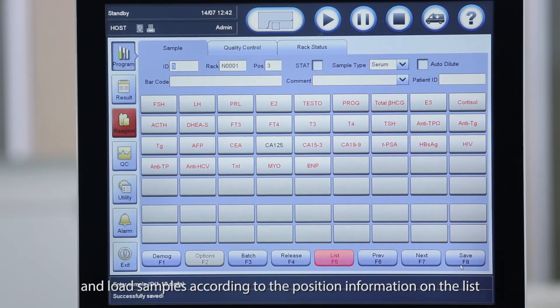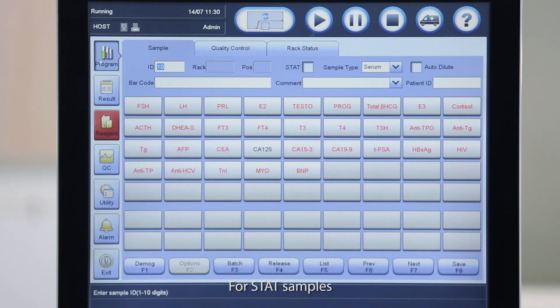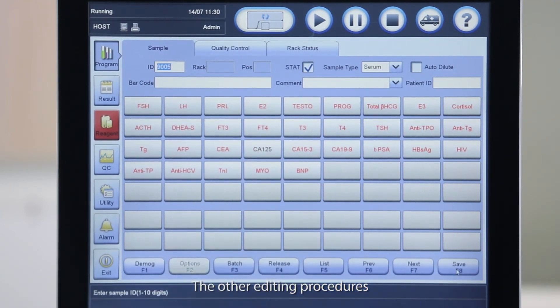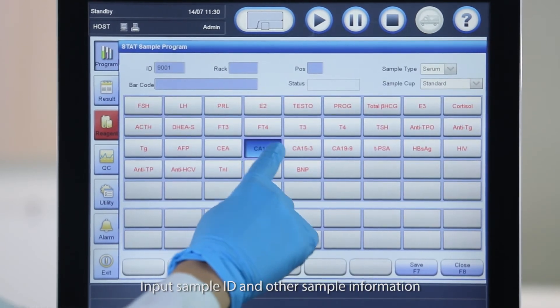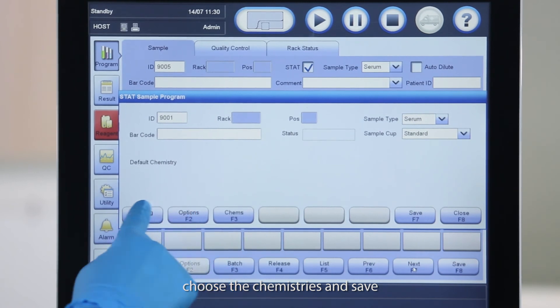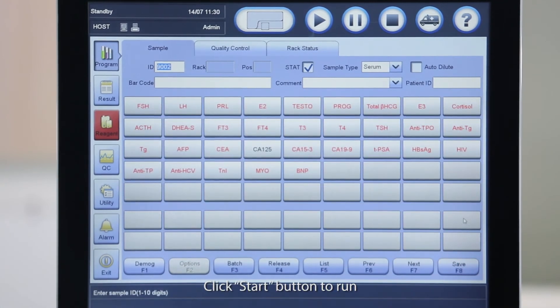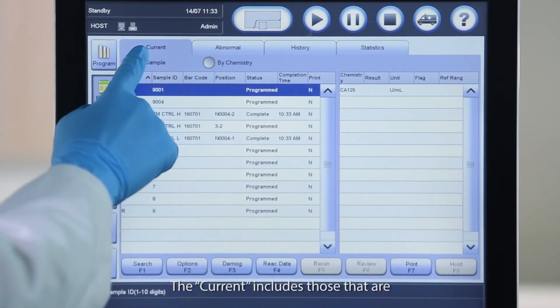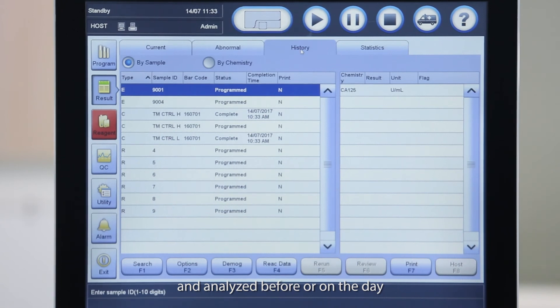Click List and load samples according to the position information on the list. Click Start button to run. For stat samples, just mark the stat checkbox before selecting Chemistries. The other editing procedures are the same as running routine samples. Or you can click the Ambulance button to edit stat samples. Input sample ID and other sample information. Choose the chemistries and save. Load samples and place the Rack in stat lane. Click Start button to run. You can view the results in current or history. The current includes those that are programmed and analyzed on the day. The history results are those programmed and analyzed before or on the day.